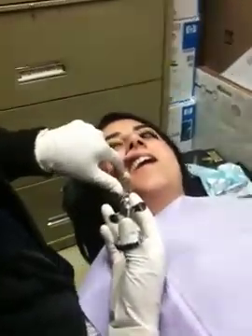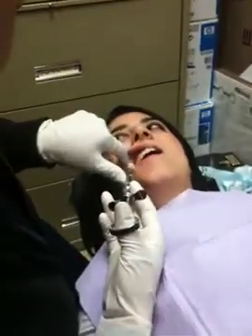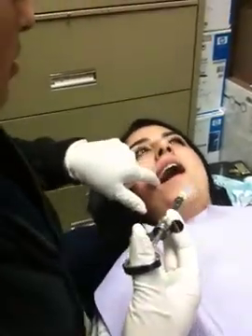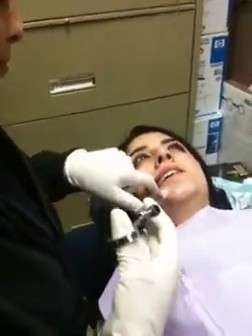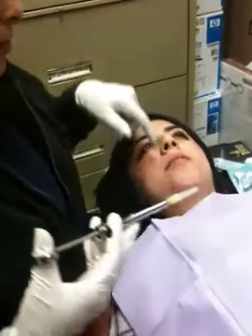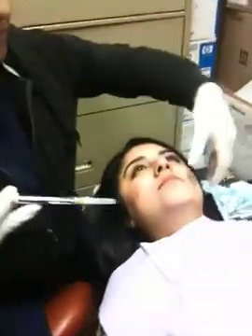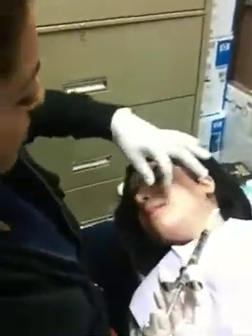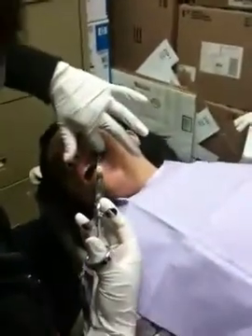Can I position my thumb here? Yeah, you can. You can use your thumb to stabilize the syringe as well. And then the bottom — you have to come from behind the patient. Turn all the way towards me. You have to turn the patient all the way towards you. And that's going to make all the difference. But again, you're going to be using your shoulder. Still use the shoulder.